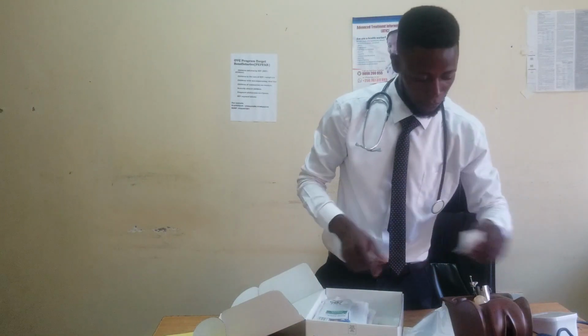Going to number 5, we have the genital specimen. In the genital specimen, you have to be creative first. We have the Cusco speculum. We have these babies. Imagine inserting a Cusco speculum in a 4-month baby, a 2-month baby, a 4-year-old or 5-year-old.